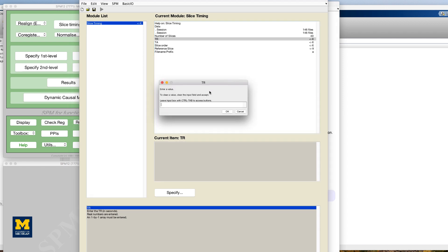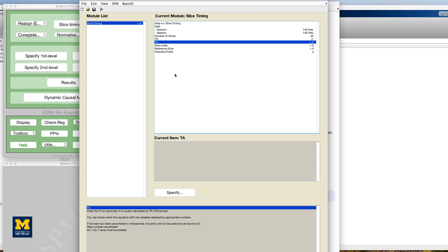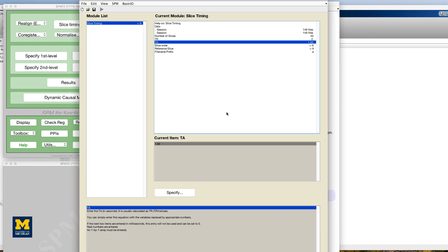For the TR, enter 2. For the TA, follow the formula provided in the help window and enter the following expression: 2 minus, in parentheses, 2 divided by 40.